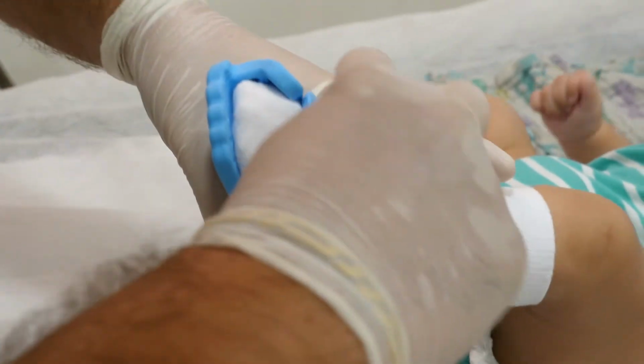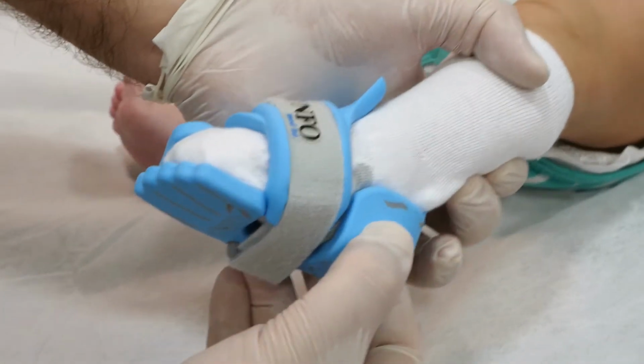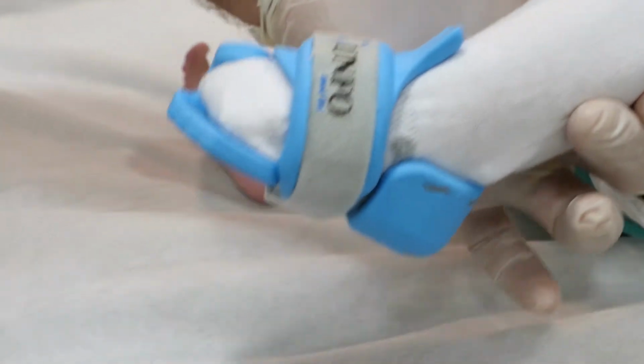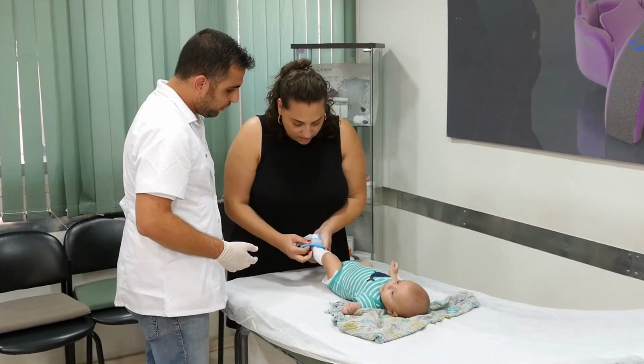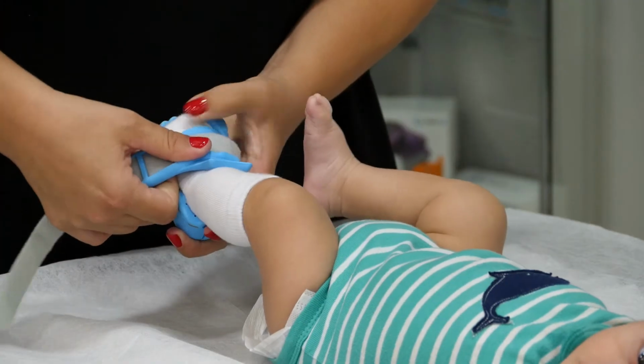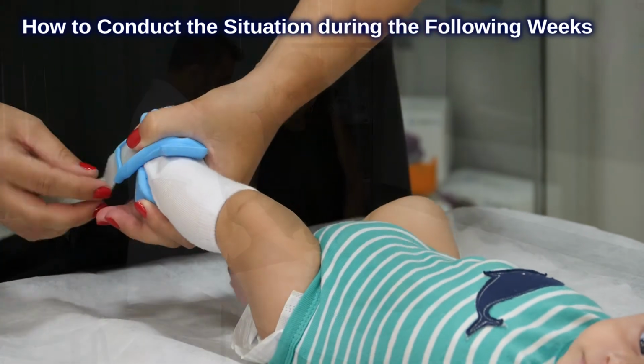Tightening the strap properly will ensure that the brace is fixed and won't move away. After finishing the setup, remove the brace from the baby's foot and ask the parents to try and perform the setup by themselves until they perform it correctly. Explain to the parents how to conduct the situation during the following weeks.